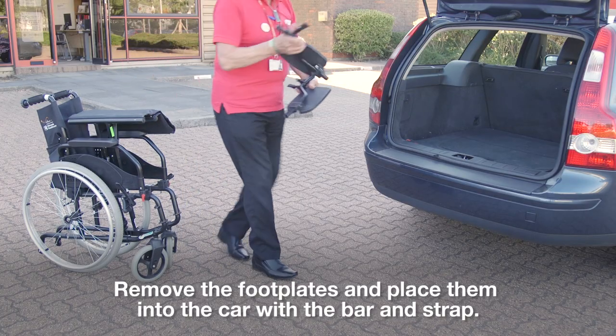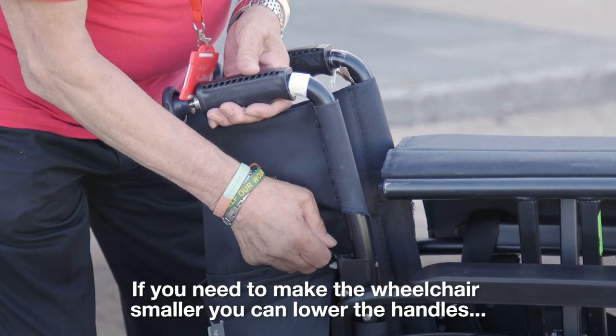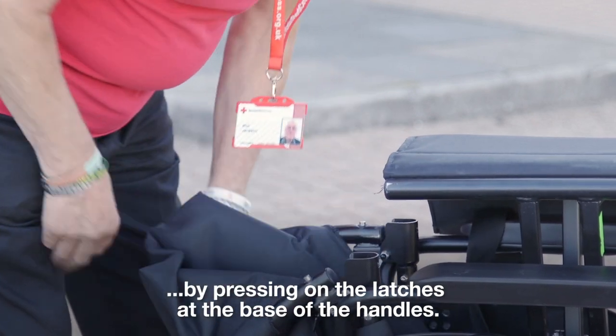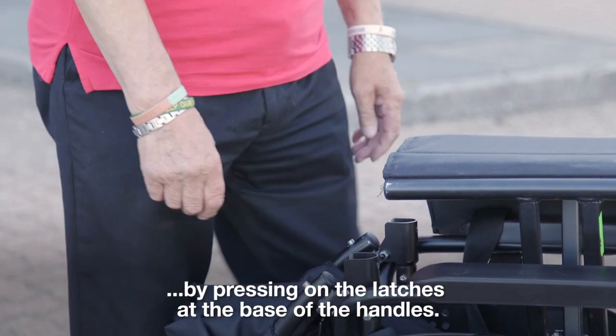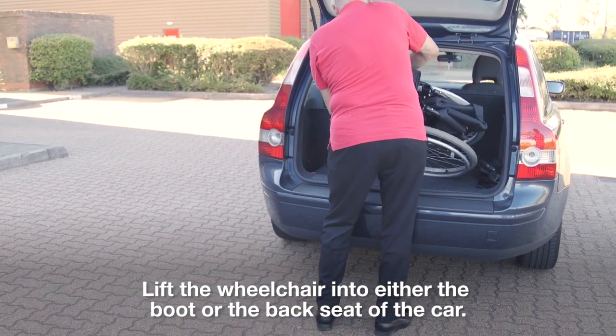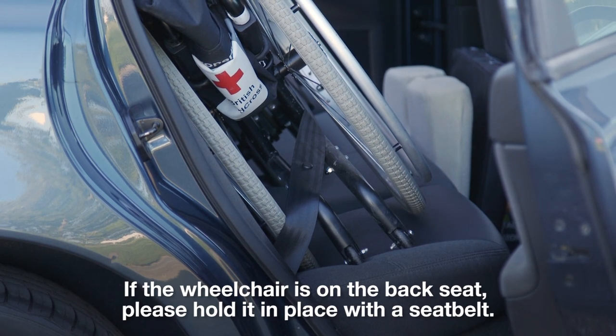Remove the footplates and place them into the car with the bar and strap. If you need to make the wheelchair smaller, you can lower the handles by pressing on the latches at the base of the handles. Lift the wheelchair into either the boot or the back seat of the car. If the wheelchair is on the back seat, please hold it in place with a seat belt.